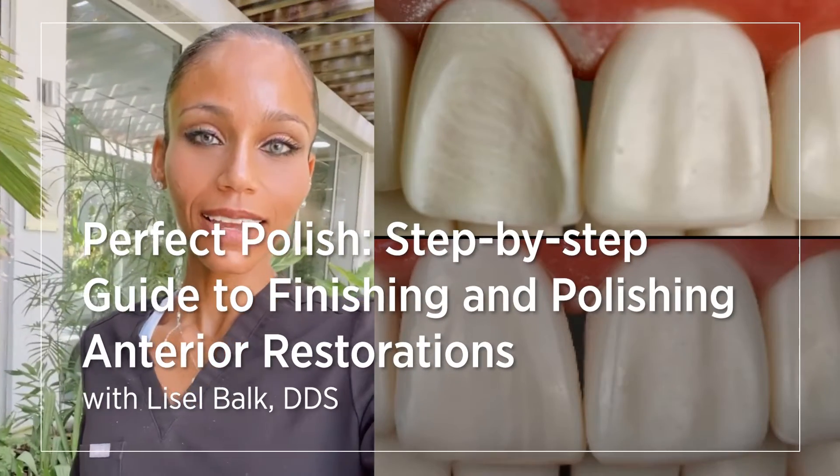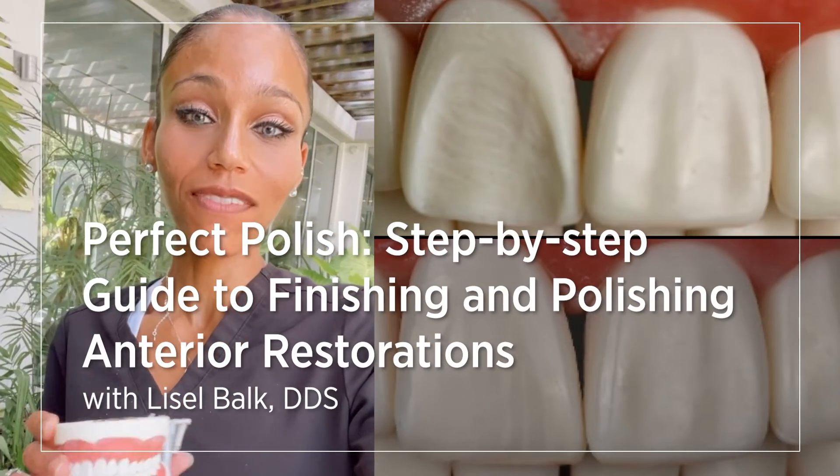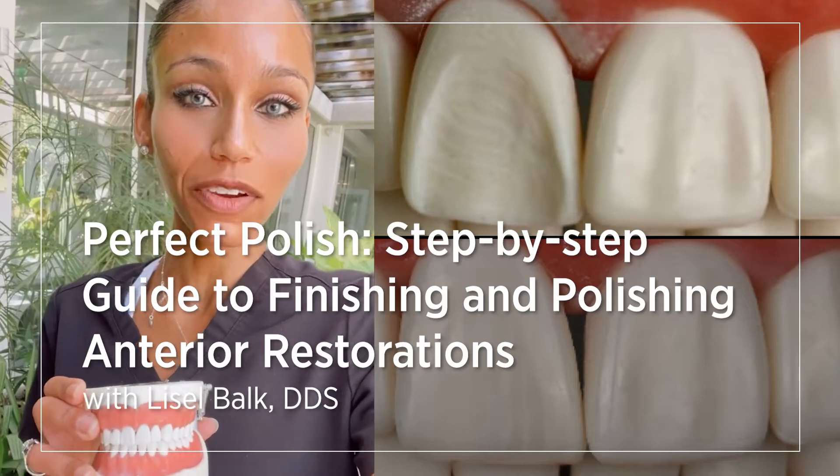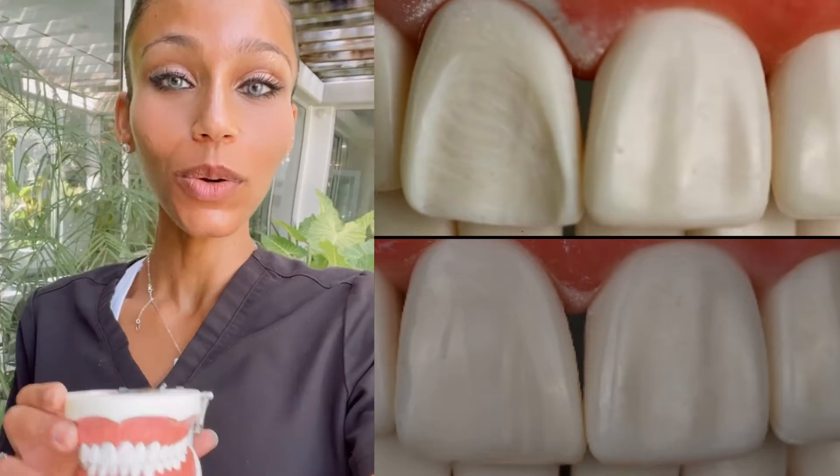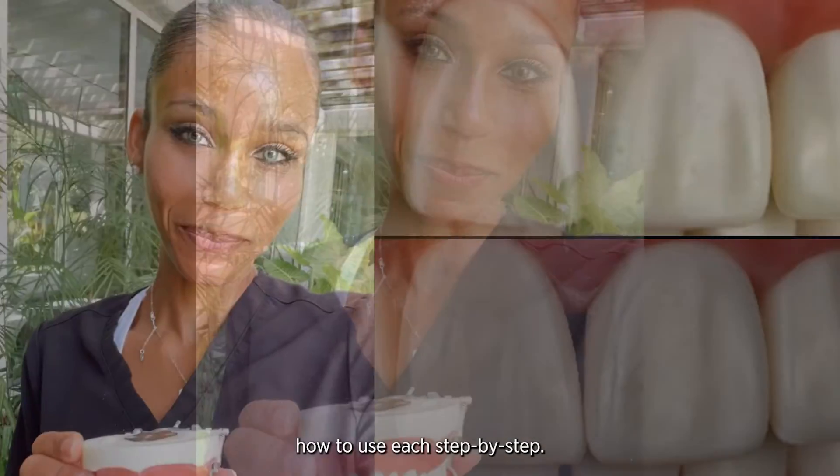Hi everyone, Dr. Lizelle here. Today I will be going through the steps of final finishing and polishing for anterior resins. I will be using a slew of Cosmodent products and I'll go through how to use each step by step.